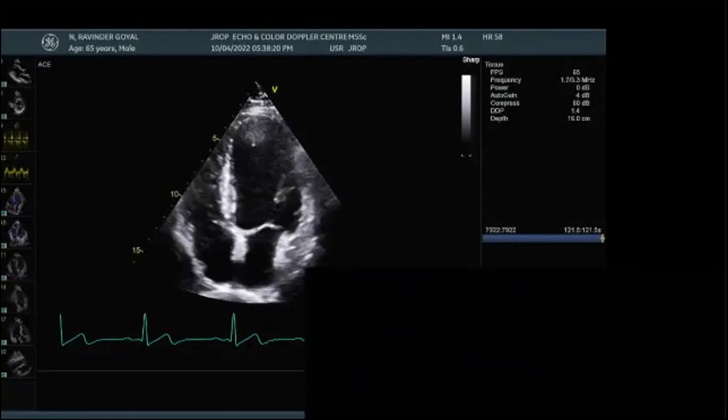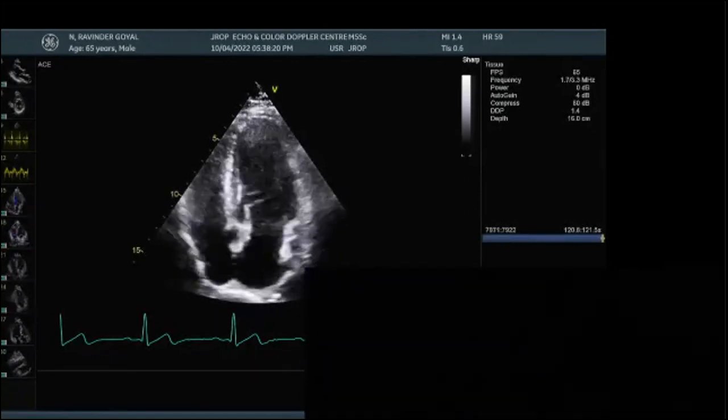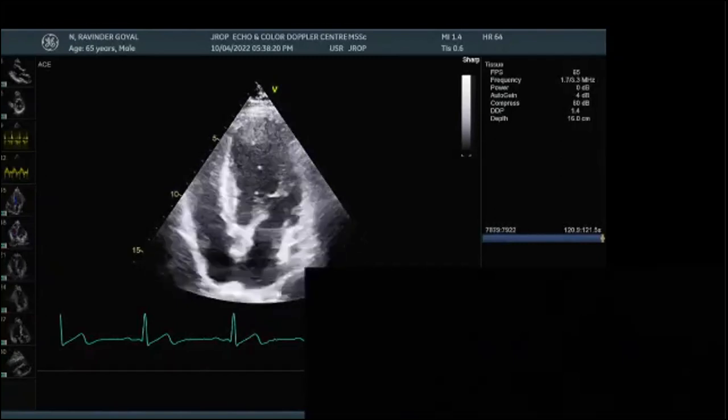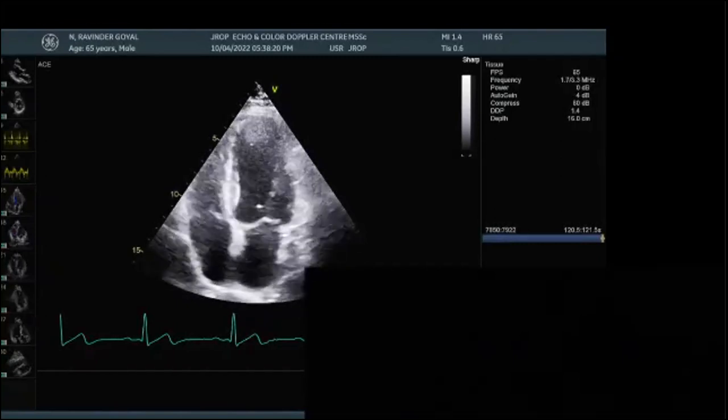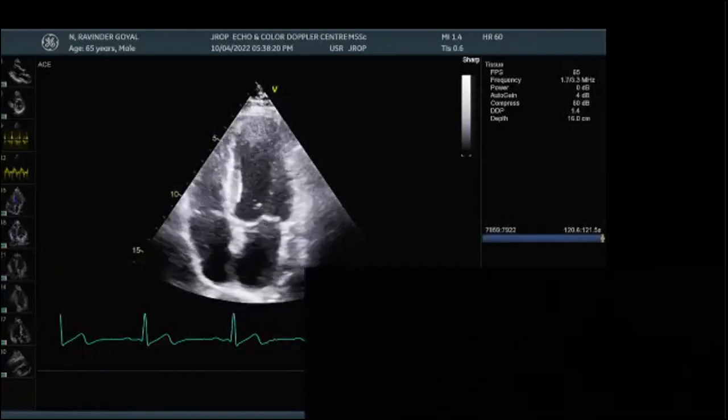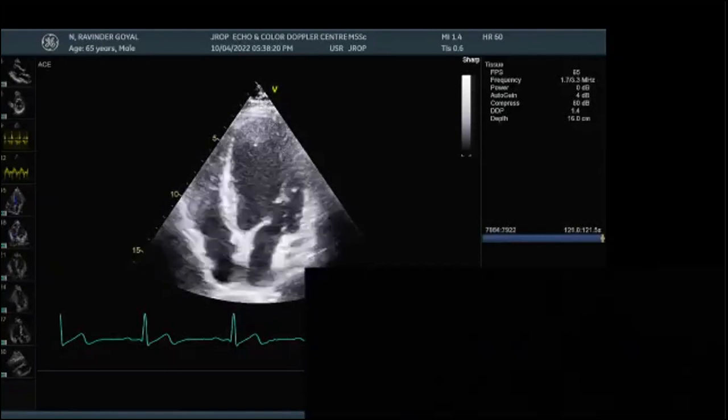Sir, what should be the grayscale exactly that should be set? Grayscale is when your image is optimized adequately. Look, you do 2D scale, now increasing the grayscale. No, sir. As you say, Nyquist's coefficient should be between 50 to 60. That is for colors. Yeah, sir. Is there any for grayscale also?